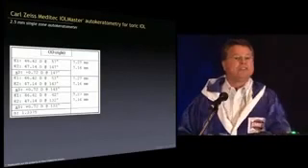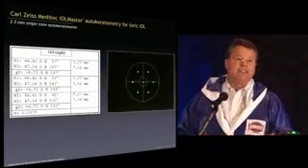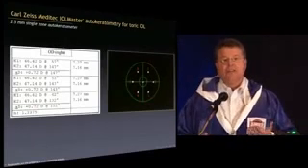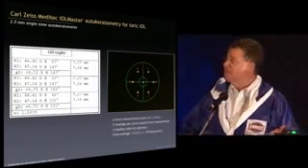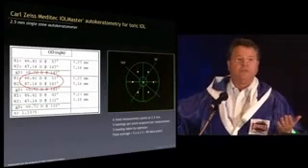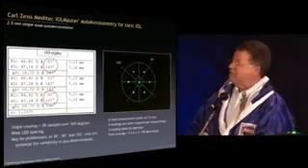Let's take a look at the IOLMaster. How does the IOLMaster work? What's behind the curtain? Well, here's what you have with the IOLMaster. You have 6 measurement LEDs. They're placed 60 degrees apart. So if you have a steep axis that's 30, 90, or 150 degrees, you have to do tremendous amounts of iteration in order to figure out where you are. So look at where the axes are. They're in the wrong zip code here for each of these measurement devices.